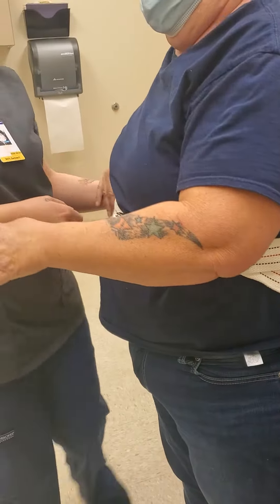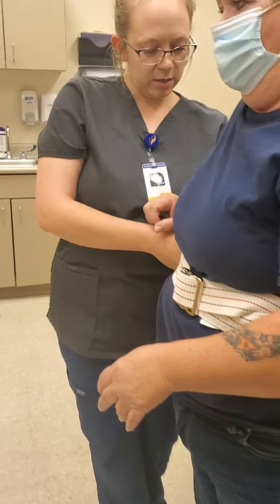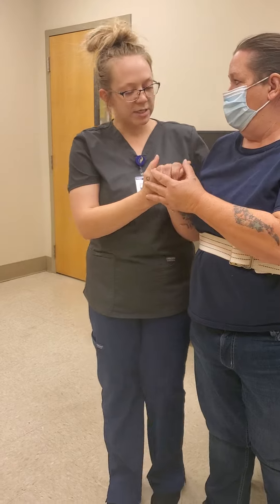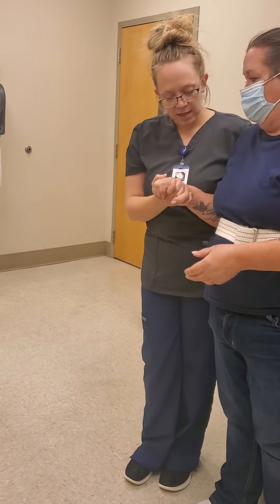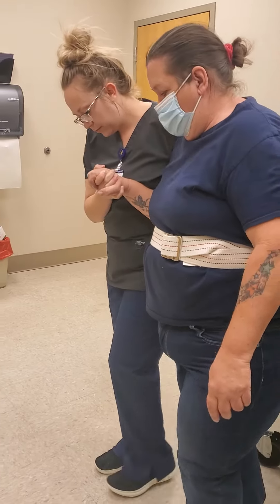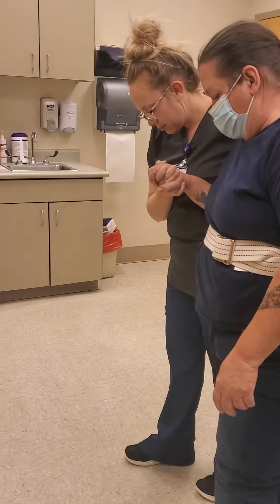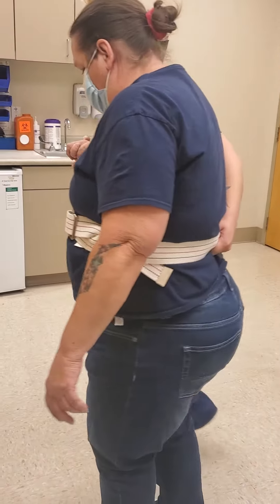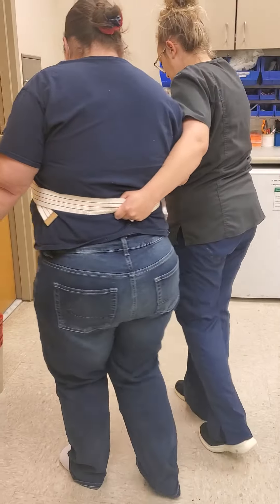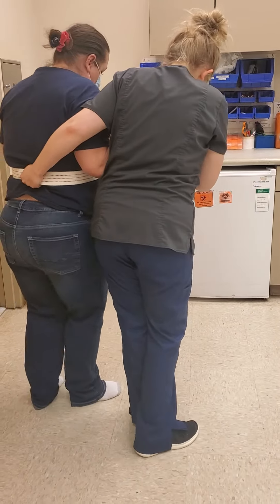Perfect, good job. Now I'm going to keep my hand underneath the belt. And since this is your weaker side, I'm going to hold your hand like this. We're going to just take little steps. So now we're going to turn — just go nice and slow.